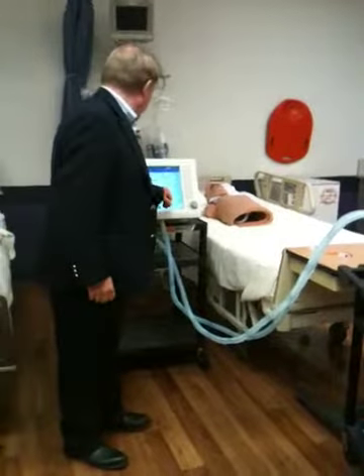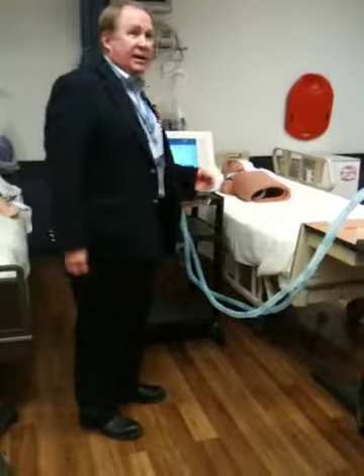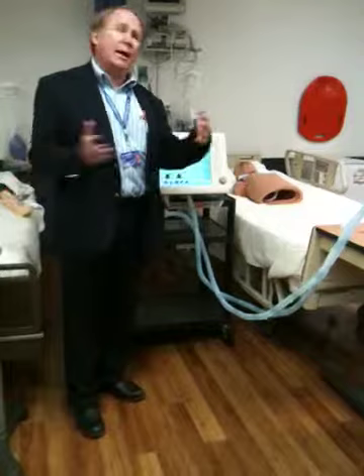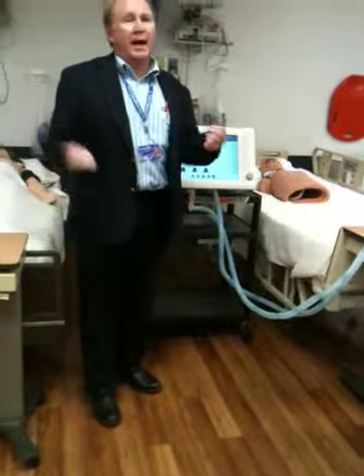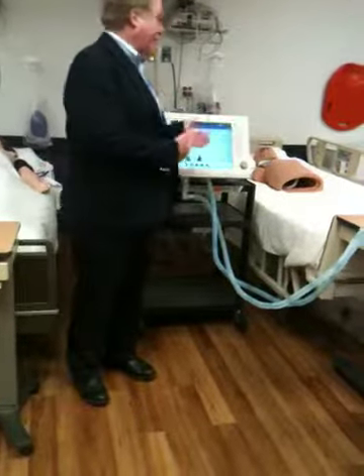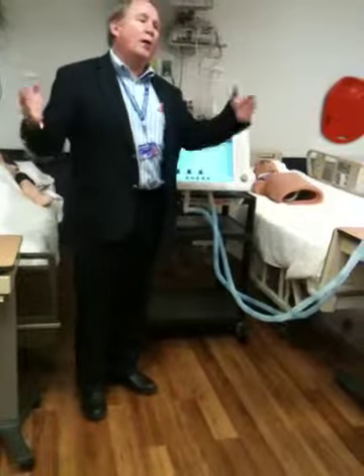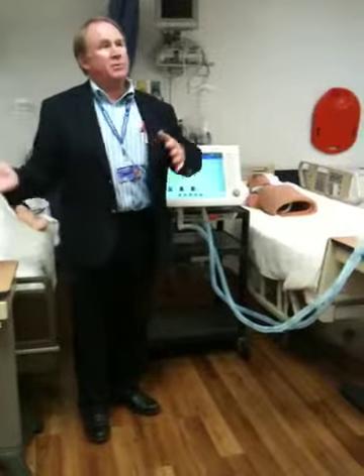But it also will go through my mean pressure, tidal volumes, minute ventilation. Minute ventilation it calculates for you. It does it combined. It measures spontaneous minute ventilation and mechanical minute ventilation. So if the patient's breathing more than I have it set for, it's going to tell me how much. In fact, it'll even tell me over time. I can look at trends on it, the data, and I can look at over the last 8 hours. What percent of the breathing was done by the patient versus the machine?